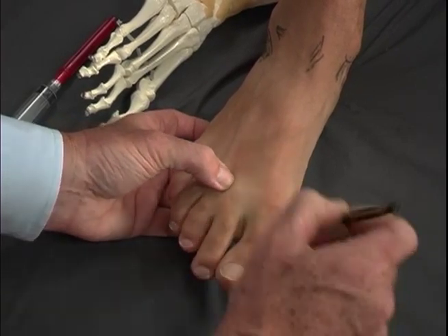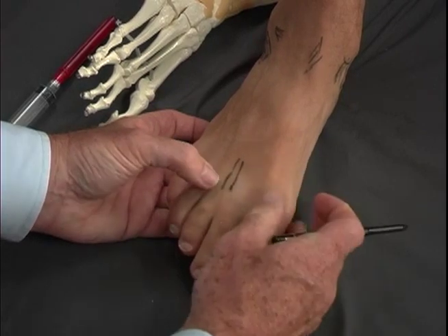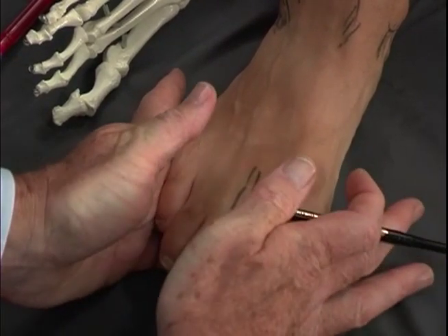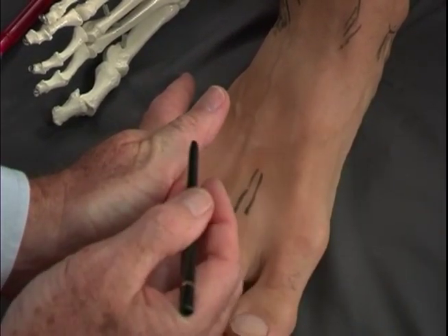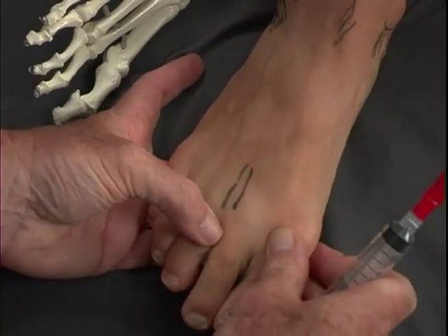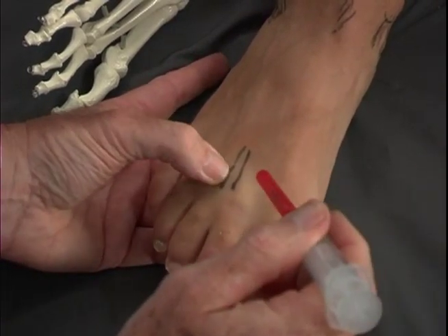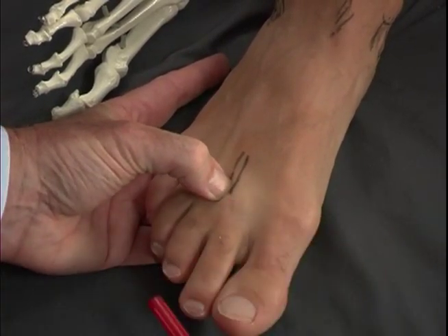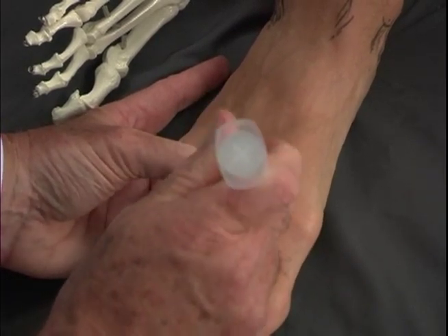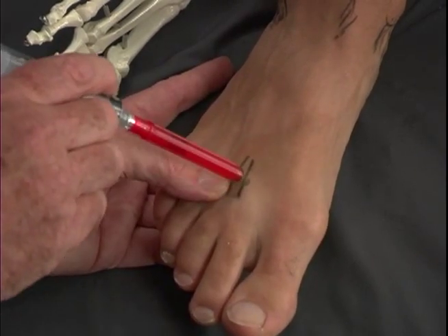We then can feel that bone on either side, which is spreading apart and is rolling like that, so that it brings the interosseous membrane up into our area of injection. So as we push up from below and spread those metatarsals apart, we then again put our finger on the area we're going to inject and come in gently to those interosseous muscles that attach between the toes.